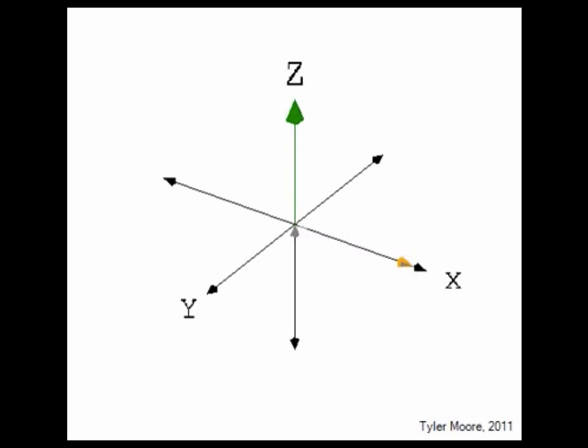And the last movie I have, and the last bit I'll talk about in terms of tissue properties, is another relaxation characteristic called T1. And actually what this measures is how long it takes for a given tissue, for its population, to get back to its equilibrium, i.e. resting state. So diagrammatically, what happens is you had some population that was aligned along Z, the main axis of the magnet. You excite it, you can either knock it partially away from there or completely, in this case, so there's no Z component here.